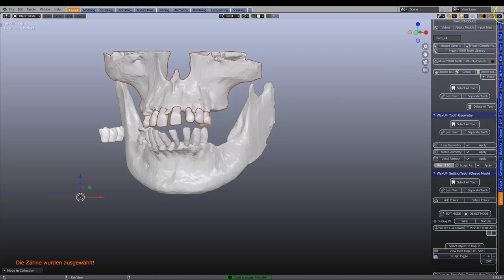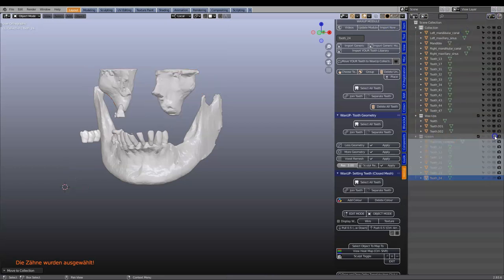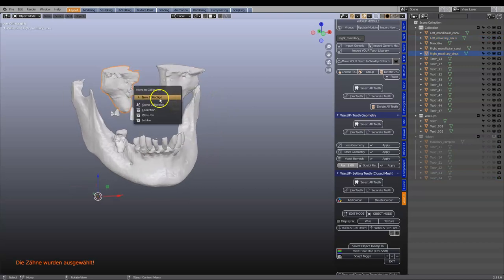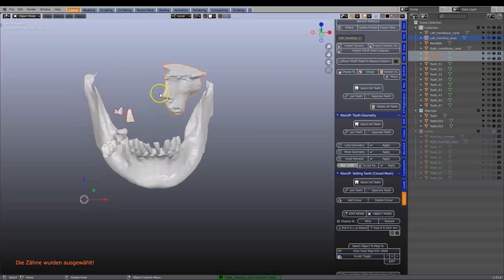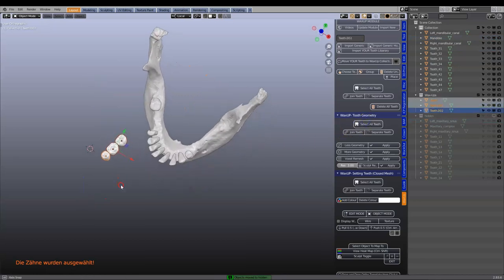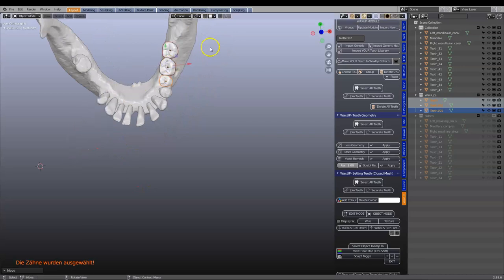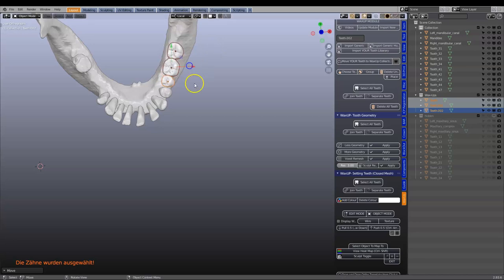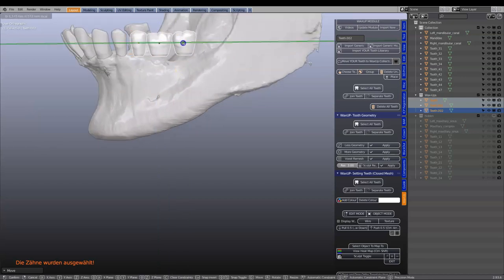We're going to semi-permanently hide that collection. The sinus airways and all of these little bits and pieces we don't need either. Now I'm going to take these teeth and put them into position — something like this. This is just an arbitrary quick way of demonstrating how this would potentially work. I'll put these sort of into occlusion.